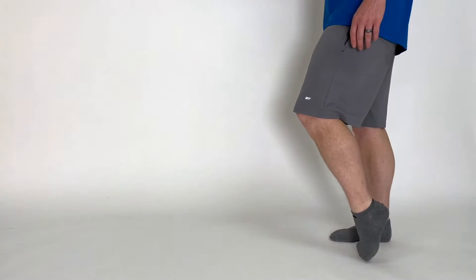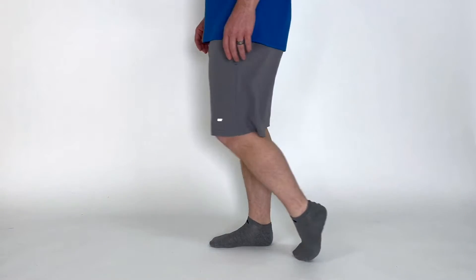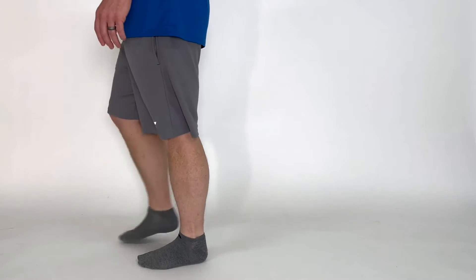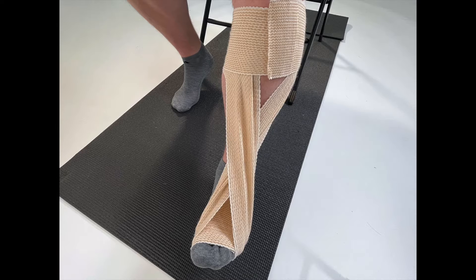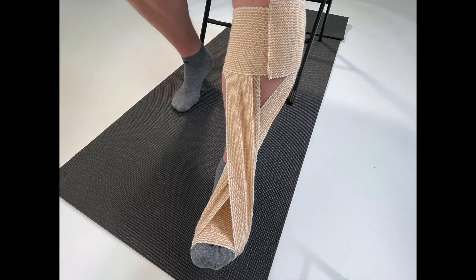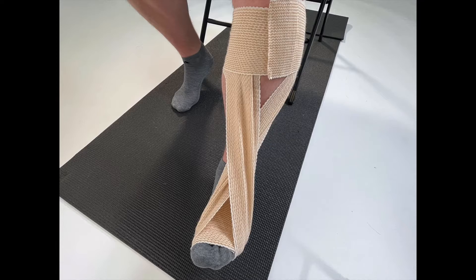Patients who suffer from a neurological disorder could result in presenting with foot drop, an increased risk for falls with ambulation and stair negotiation. One option to maximize the patient's independence with these functional tasks is to apply a dorsiflexion assist with ACE wrap.